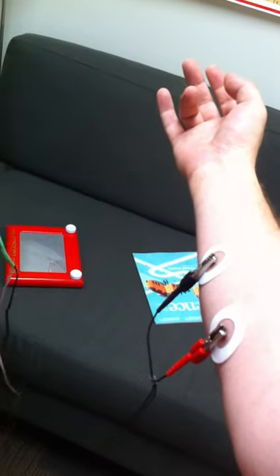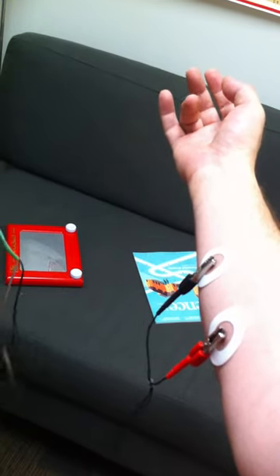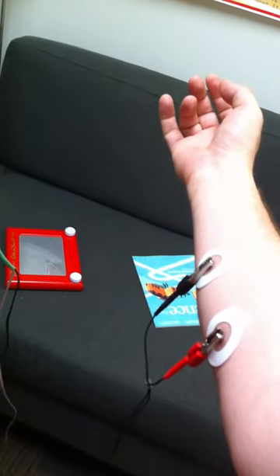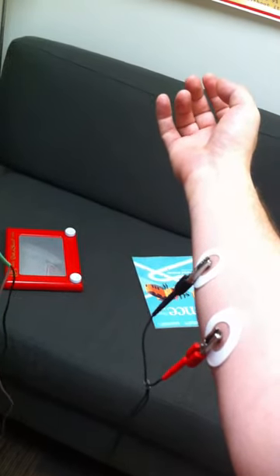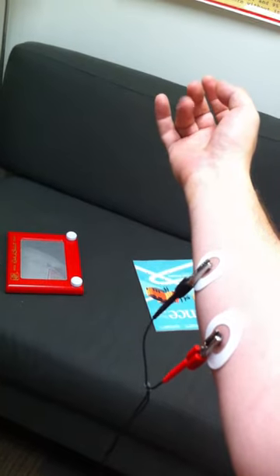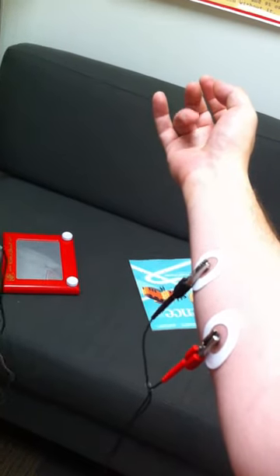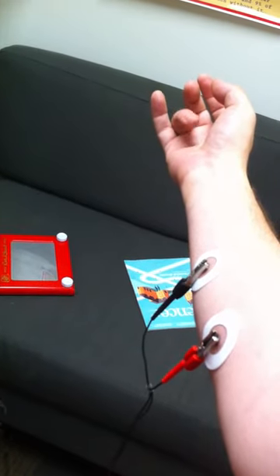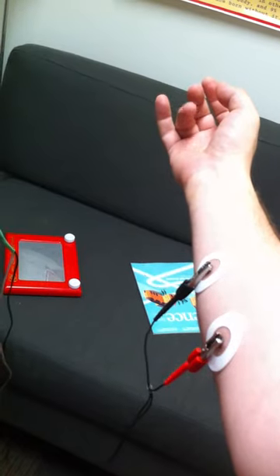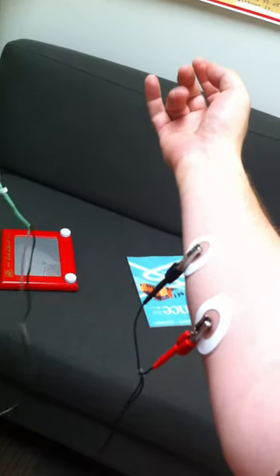There's probably other nerves you can get. Yeah. You can still feel it. You can put it anywhere. You can put it on your calf muscle. Get a total body workout. Wow. Oh, this is gonna ache tonight.